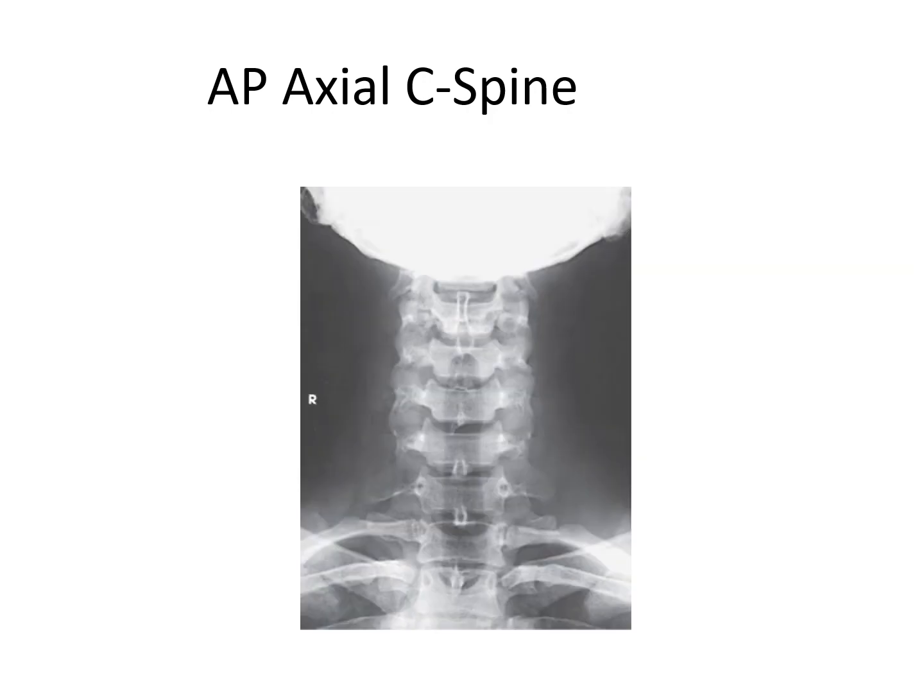And that's what it'll look like. Nice, tall. Right in the middle there, you can see the black stripes that are going horizontal. Those are intervertebral discs. And in between those, the ice cube shaped things, those are the vertebral bodies. Now, superimposed in the center, there's a couple structures there. First of all, there's an air-filled trachea, so that's good. Your patient's still breathing.